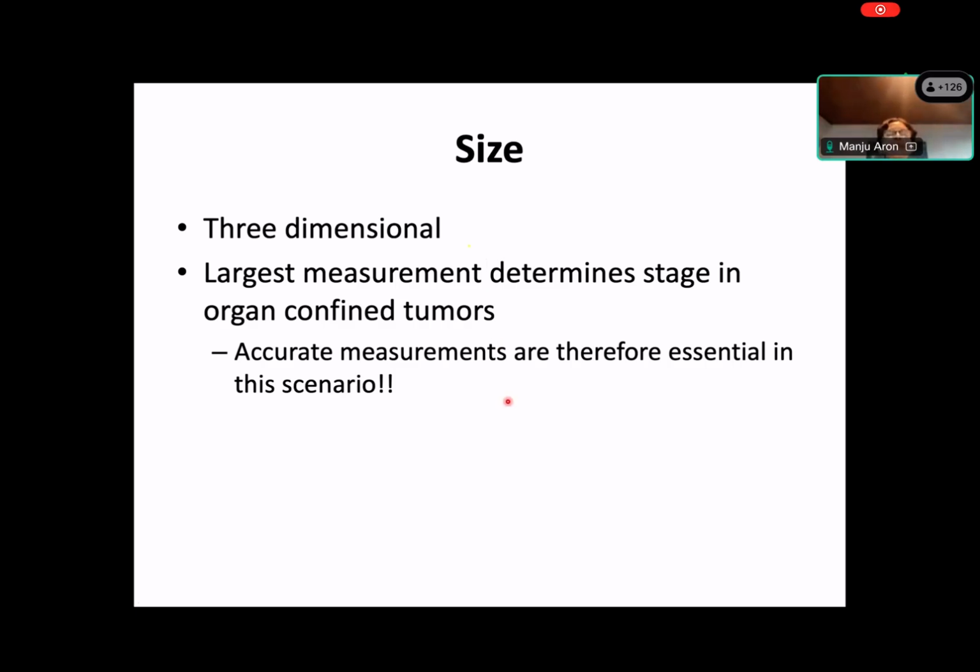And okay, so awesome. So let's go on to the size. I hope you guys could see, and really the previous slides were just to show you how important it is to document the relationship of the tumor to the various adjacent organs, the perinephric fat, renal sinus, and also the collecting system. Okay, so let's go on to the size.